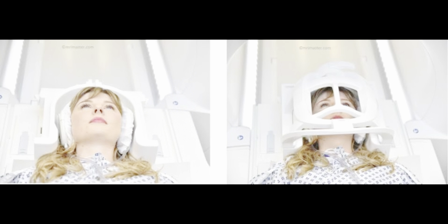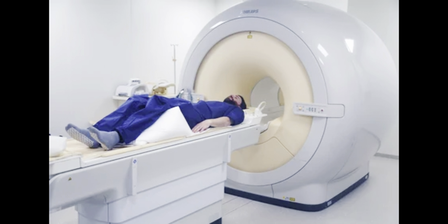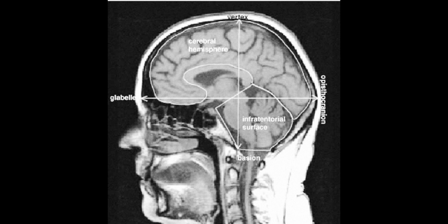So firstly, we position the patient after completing all formalities. Lie the patient down on the table in supine position. Place the head coil on the head of the patient and cushions for immobilization. Also give cushions under the legs for extra comfort. Center the laser beam localizer over the glabella.